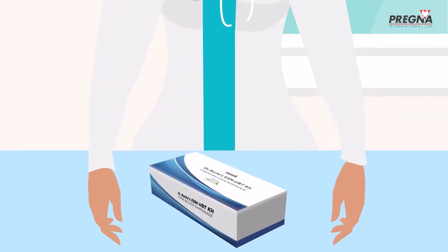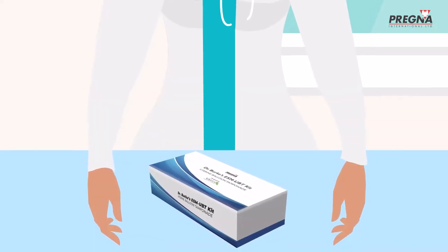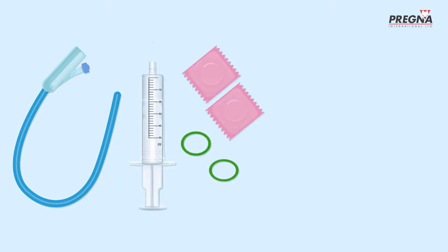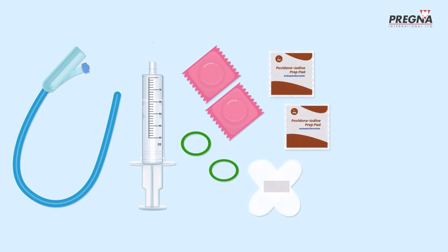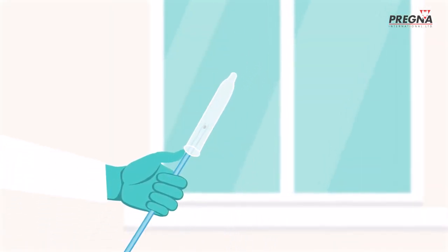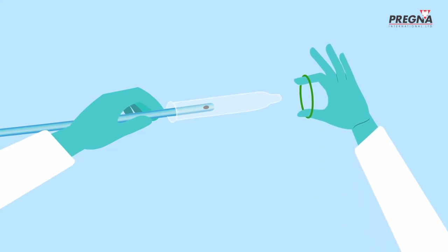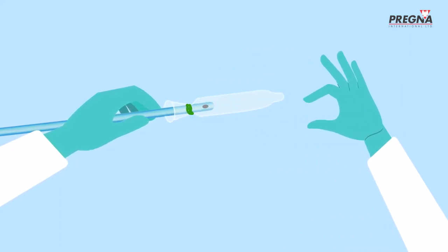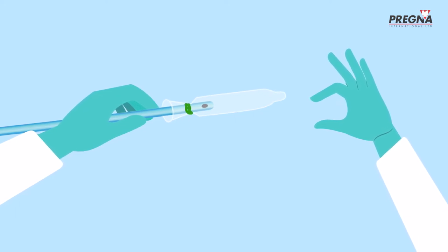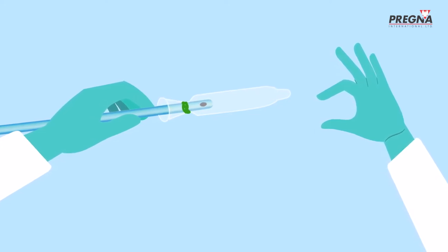Anita must now use Dr. Burke's ESM UBT kit. She puts on sterile gloves and opens and assembles the kit. The kit contains a Foley catheter with a one-way valve inserted at one end, a large 50ml syringe, two pieces of o-ring, two condoms, two iodine wipes, a catheter holder, and a user manual. Anita inserts the Foley catheter halfway into the condom balloon, leaving a small portion of the condom beyond the tip of the catheter. She then carefully wraps one silicone o-ring four times around the base of the balloon, ensuring it is neither too loose to allow saline to leak, nor so tight that it will prevent the inflow of liquid.